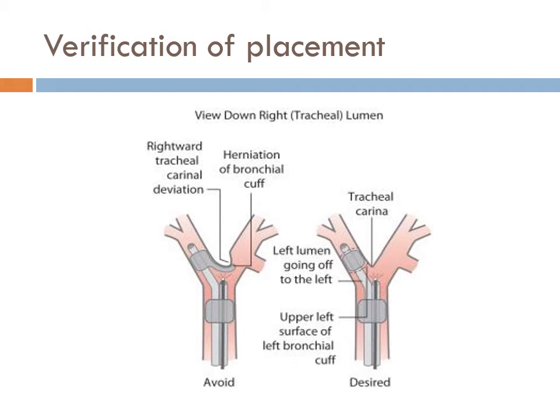The problem with pressure control is that the volumes are variable, so when you're ventilating, you don't know when there's a leak unless you're paying attention to your compliance or the tidal volumes you're getting for that set pressure. I noticed my volumes changed when they shouldn't have. They also could change based on whether they're assisting, on PSV Pro, or on straight mechanical pressure control. This person was spontaneous, so again, it could vary. And so I realized that really the compliance changed.